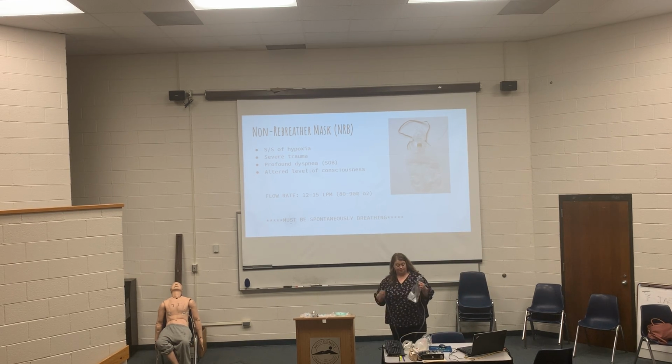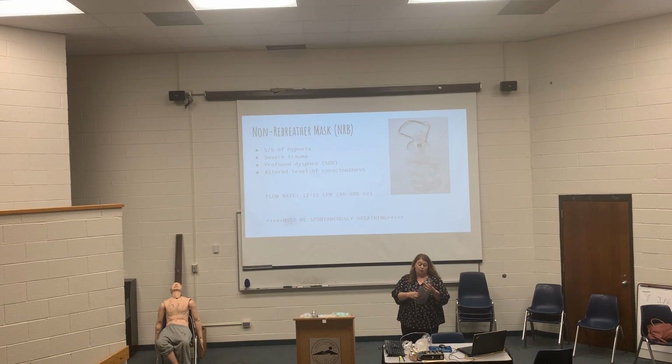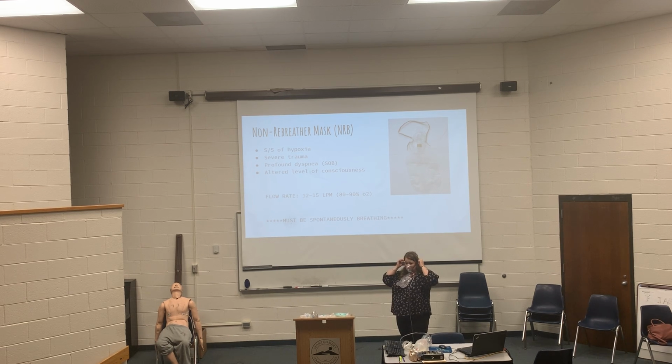So when you go to hook this up, it'll come apart like this. Either side will hook in, and you'll hook this to the tank of the truck. What I always do so it fills up faster: now this will fill up eventually without you pressing on it because it has this little seal right here, but I always hold it down so that way it fills up faster. And then once that's filled up, you're gonna put it on the patient like this, like a flight attendant, and make sure it's above the ears and adjust this nose piece to where it fits snug on there.